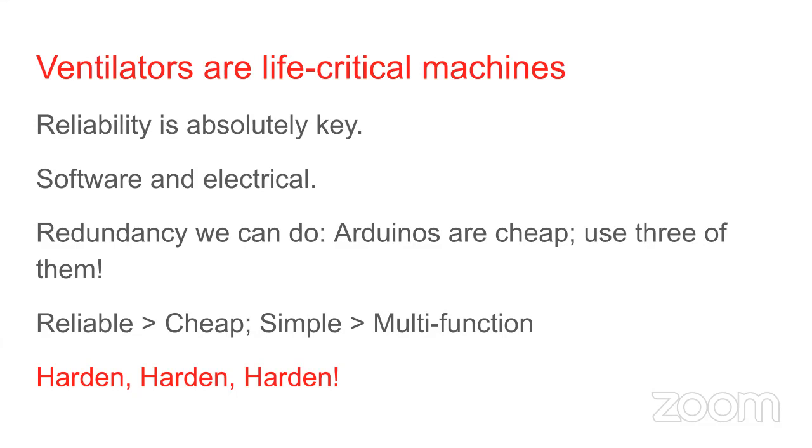I'm very fast and very sloppy. I am a terrible person to work in this domain. Nonetheless, I'm trying. Reliable is better than cheap, and simple is better than multifunction. I know we need cheap ventilators in this situation, but it doesn't do any good if we kill the patient. Even in the places that I personally believe are going to be very hard hit, like India, we have to build reliable machines.